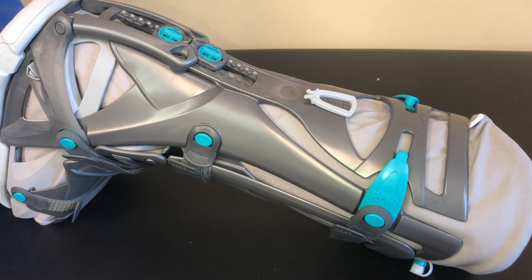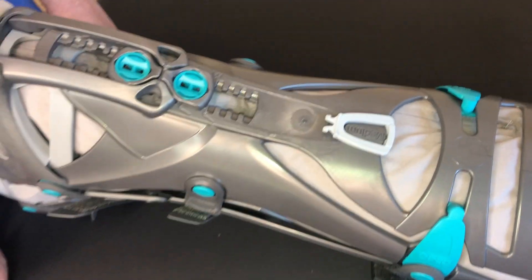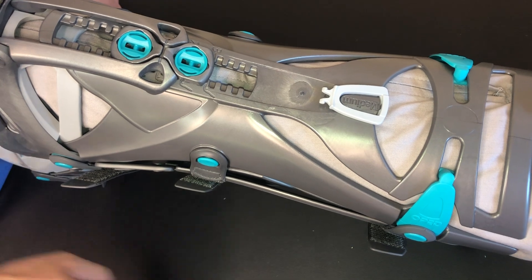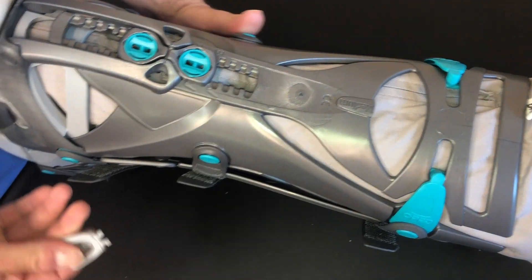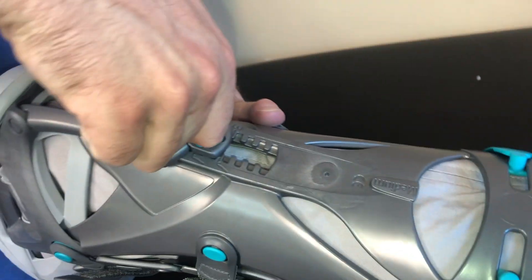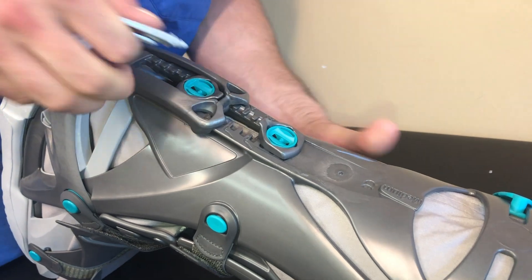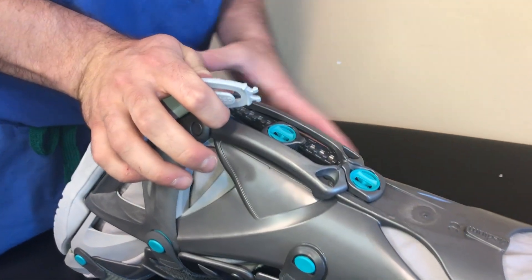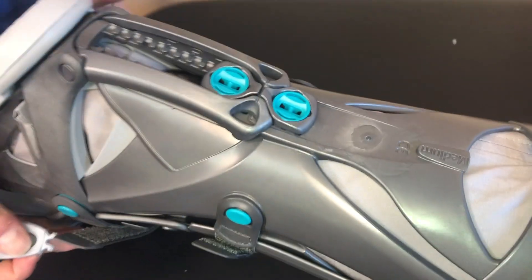If instructed to unlock the boot, first locate the small light gray key. This key is mounted on the back of the boot above the range of motion restrictors. Place the key inside the restrictor you wish to unlock and move. Turn the key to the right, landing in the horizontal position. You may then need to slide the restrictor up or down to a different position. To lock in place, turn the key to the left, landing in the vertical position.